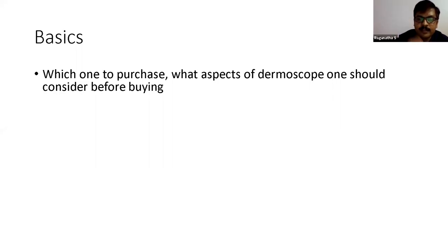Most of the time, our residents, especially postgraduate students, are using dermoscopy for their thesis and research purposes. I would like to know whether to go for video dermoscopy or handheld dermoscopy, because at the end of the day they have to publish, and the picture quality should be very good, and the details of the changes you see under different dermoscopes are different.